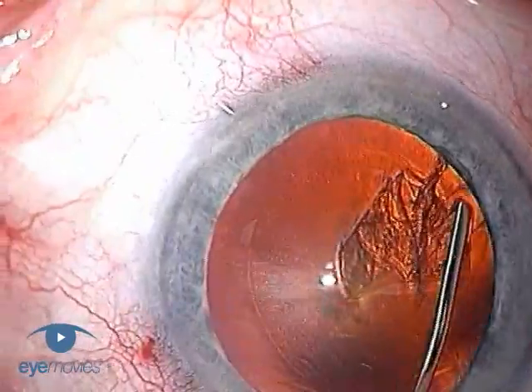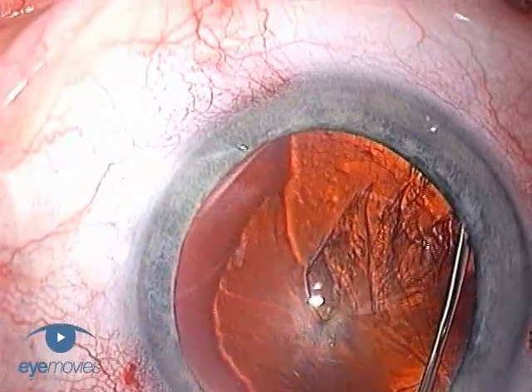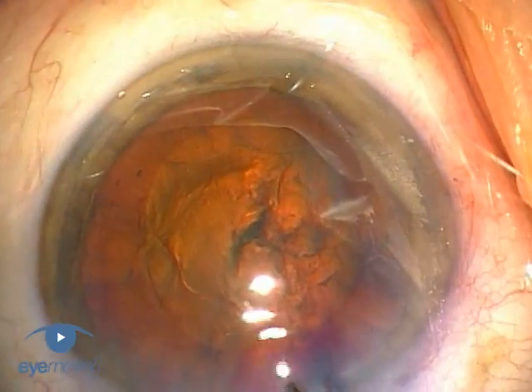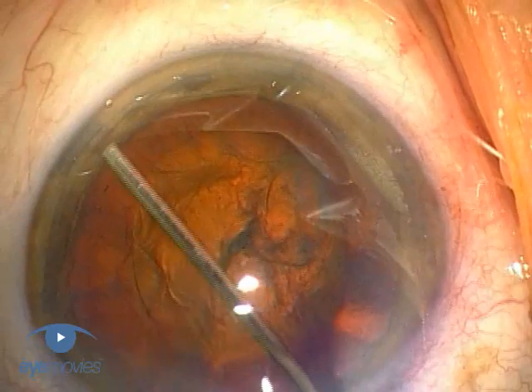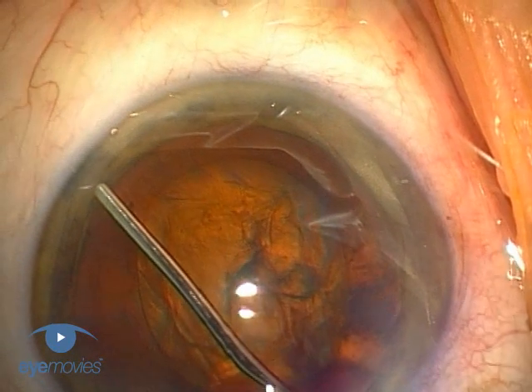This is easy enough when the edge is clearly visible, but when it's not so obvious there's still a simple way of consistently finding the right plane. To do this, just rest the tip of the cannula on the surface of the capsule, and while applying gentle downwards pressure, slowly draw the cannula towards the centre.